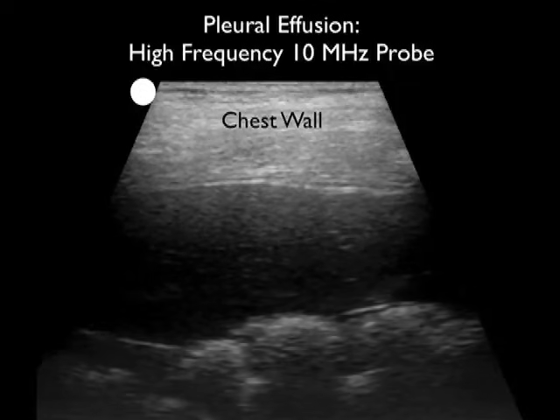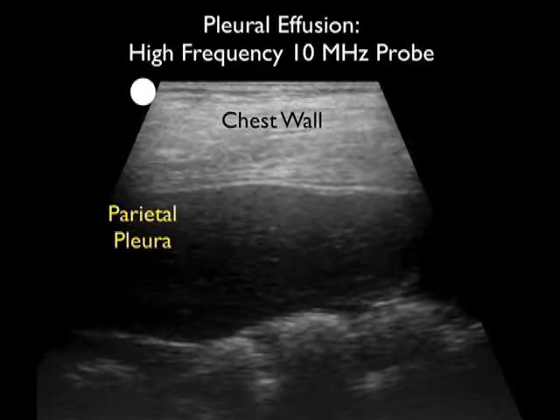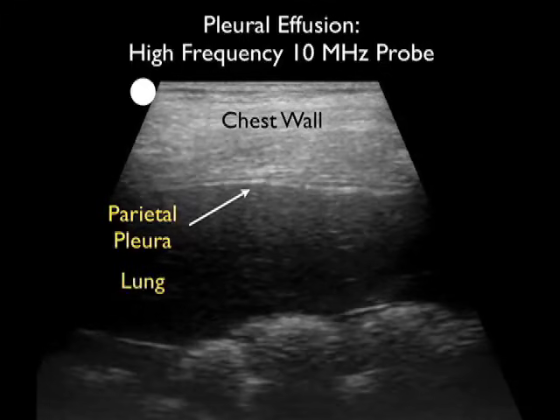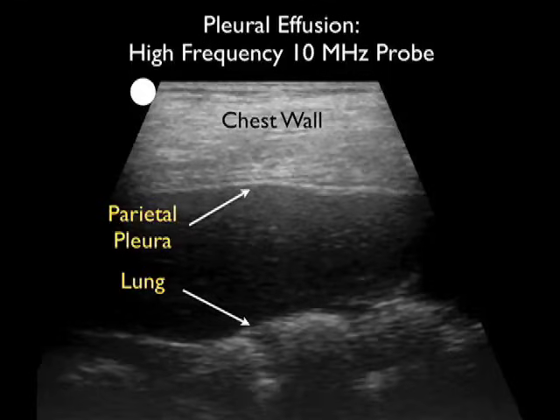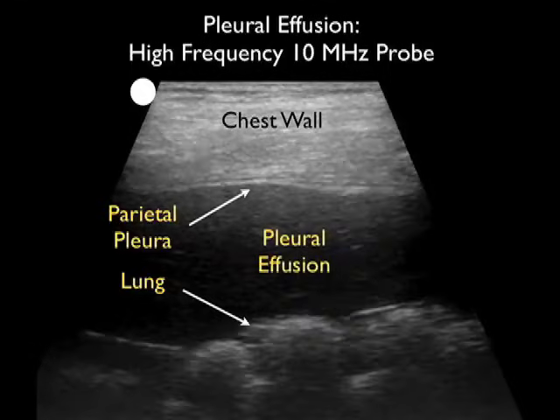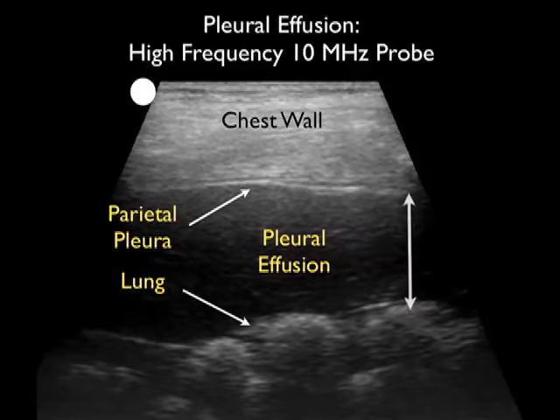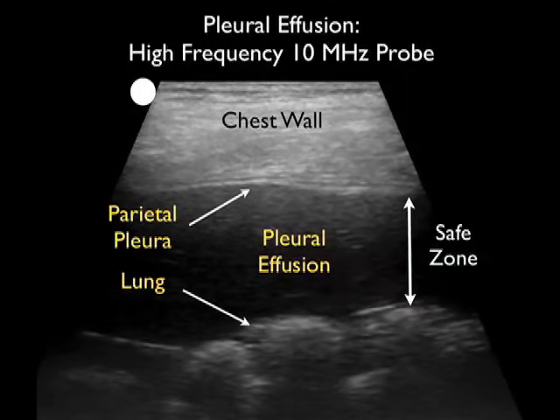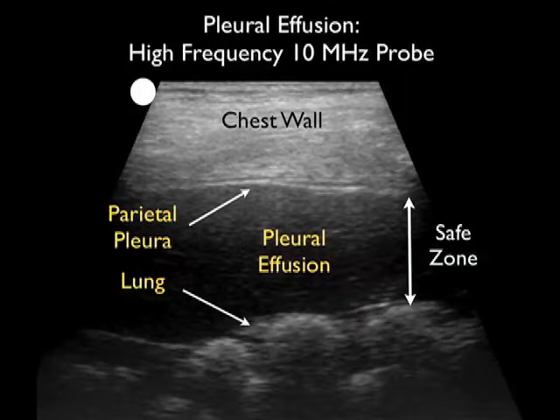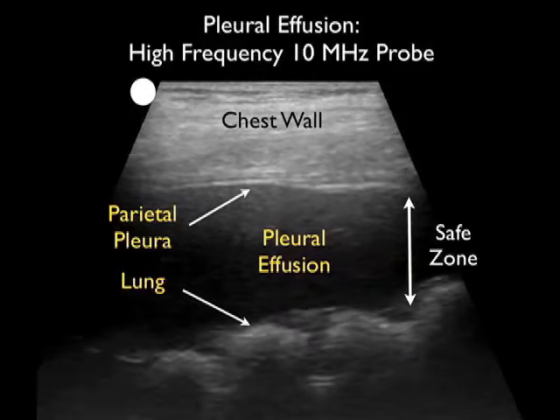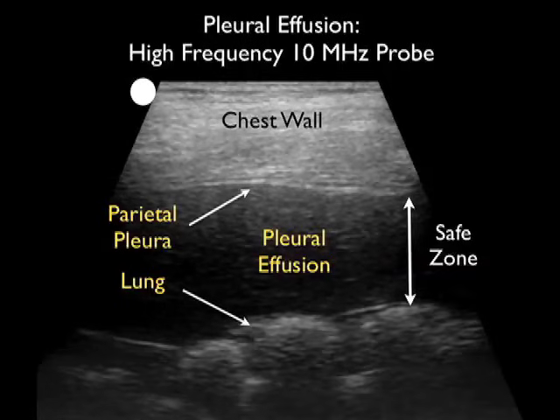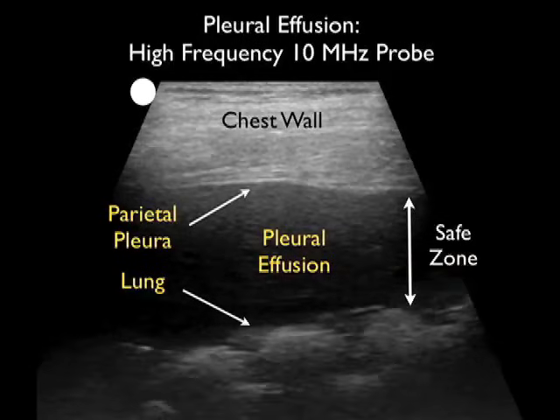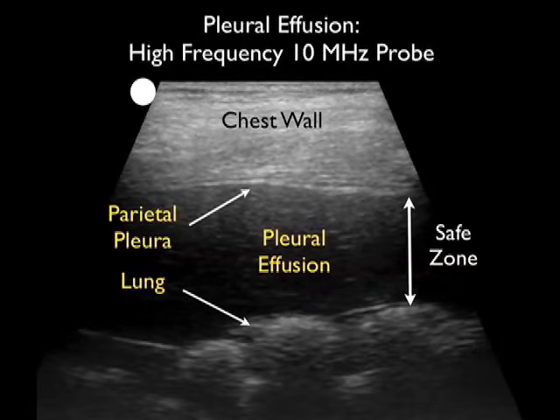This ultrasound image is again taken with a high frequency 10 megahertz probe, but in this orientation the probe is configured between the ribs in the lateral orientation, so all we see is the chest wall anteriorly. We see the parietal pleura — that white line deep to the chest wall — and just deep to the parietal pleura we can see the pleural effusion as made up by the darker anechoic collection of fluid. We also see the lungs sliding back and forth as the patient breathes, and we can see the full extent of the pleural effusion, which is the safety zone for performance of the thoracentesis procedure.